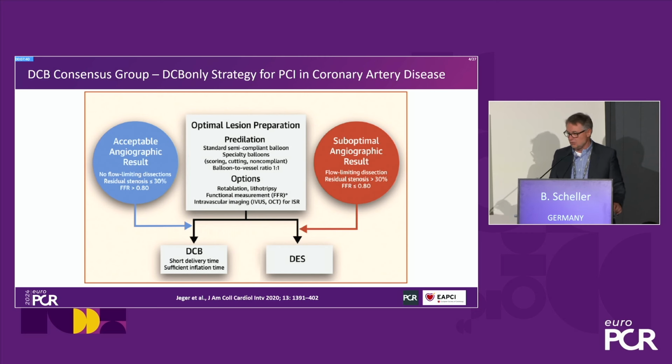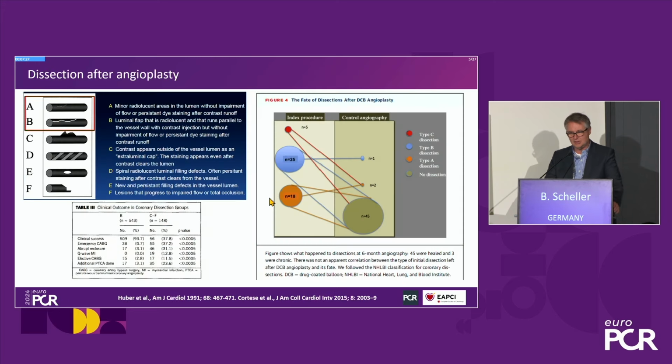The basic principle has also been discussed. DCB only means lesion preparation is the key of your whole procedure, and after that you can decide if you use DCB or a DES, and that's a good thing. Dissections we have already discussed.